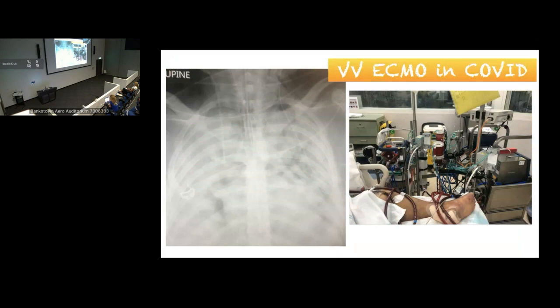just too high. Now, if you go back to what I was saying about ECMO flow and oxygenation, the CARDIOHELP is only rated to 6 litres of flow. In this patient, being both obese and septic, his cardiac output would have been upwards of 12 litres. So we're only really being able to oxygenate about 50% of his blood, and he had no tidal volumes on the ventilator, which you can see illustrated by the chest X-ray.